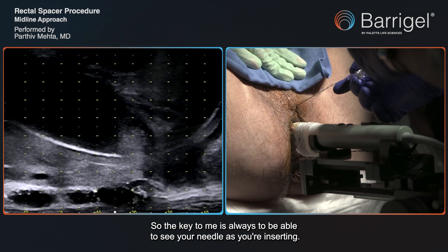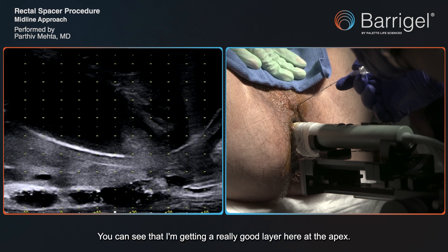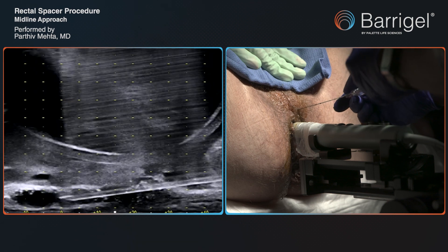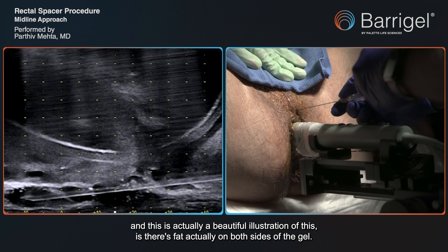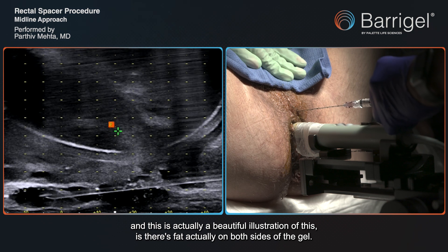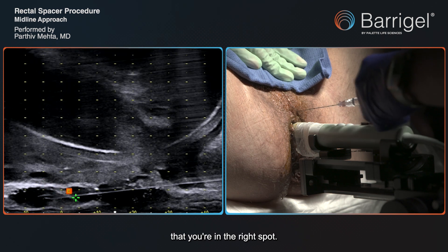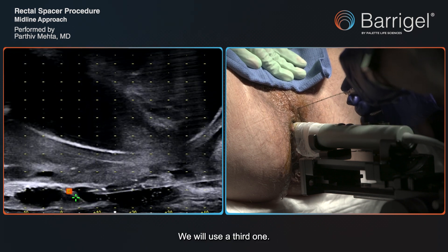The key to me is always to be able to see your needle as you're inserting. You can see that I'm getting a really good layer here at the apex. What I always like to see — and this is a beautiful illustration — is there's fat actually on both sides of the gel. The white again is the fat, so you can see there's a fat layer here and a fat layer on top. That just tells you once again that you're in the right spot. We will use a third vial.